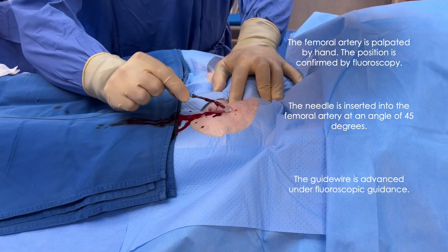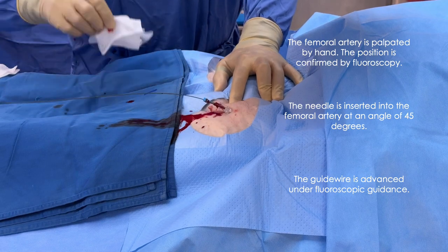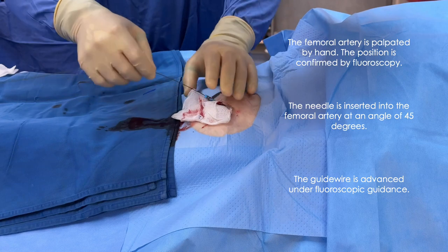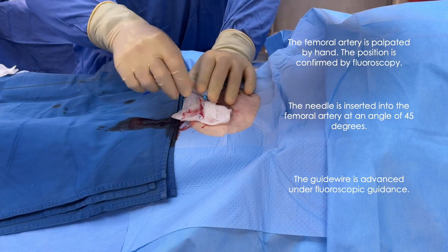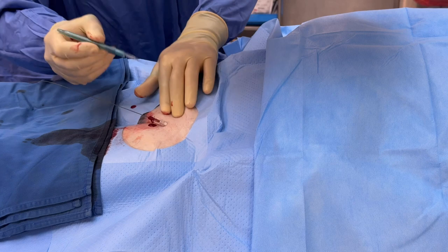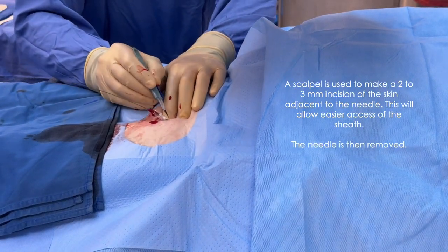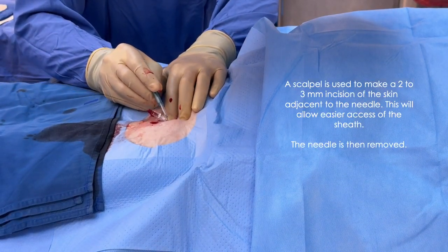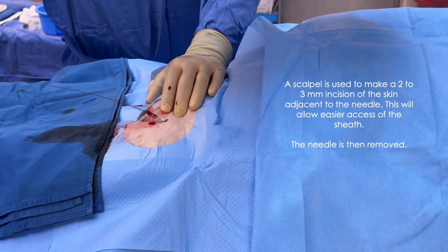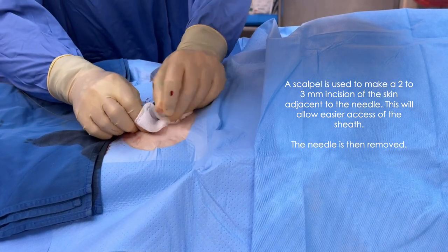The guide wire is advanced under fluoroscopic guidance. The scalpel is used to make a 2-3 mm incision of the skin adjacent to the needle, which will allow easier access of the sheath. The needle is then removed.